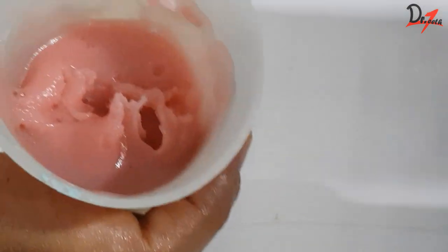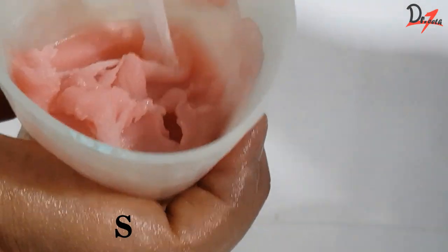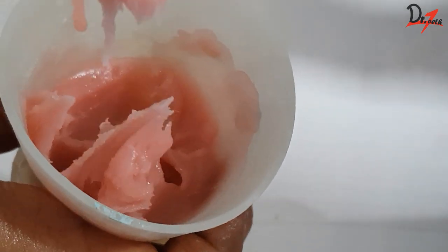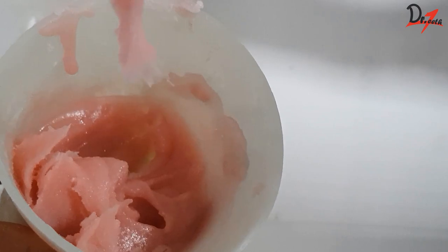The next stage is the stringy stage, as you can see here. We can see that strings are forming — hence the name. The material at this stage will be sticky. Never manipulate it at this stage, or you will definitely be in a mess.